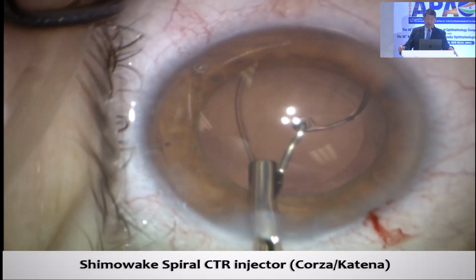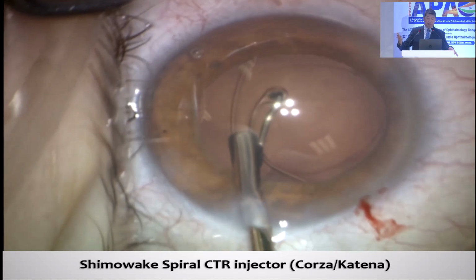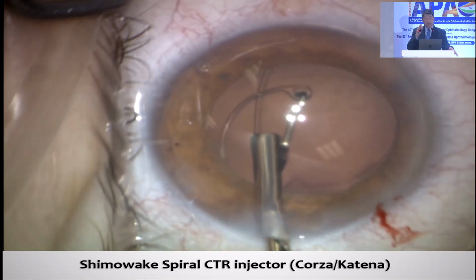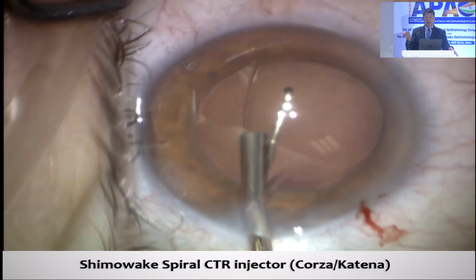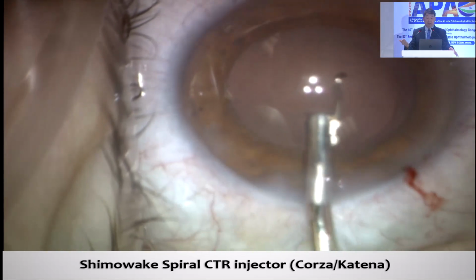And so this is very ingenious. I keep injecting it. It doesn't put any pressure on the zonules, and you basically tilt it, and then the lead haptic falls off. You tilt it a little more, and the trailing haptic falls off.